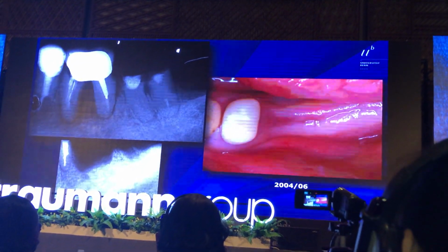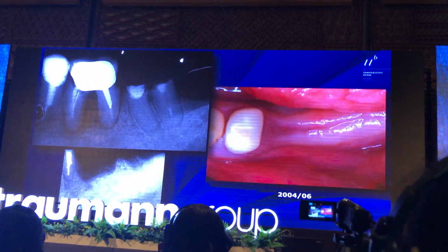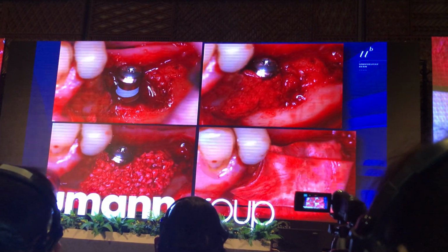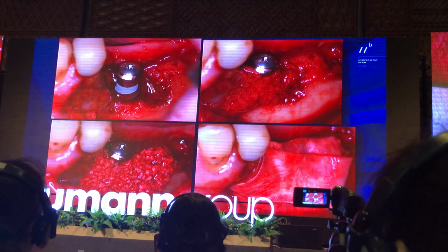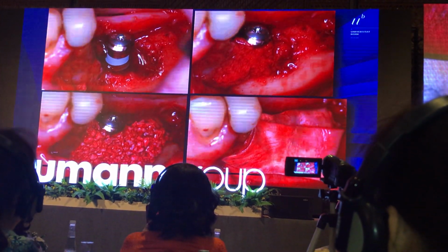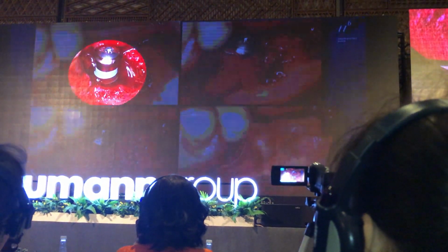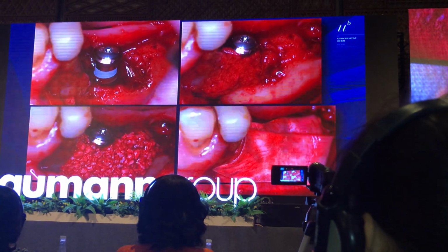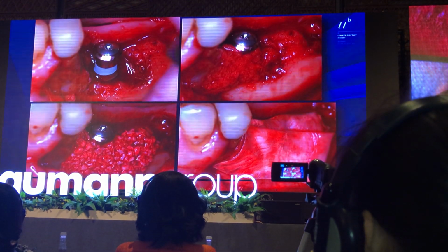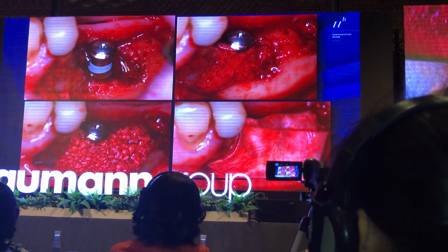And I said, oh my goodness, what was the problem here? Big lesion. So, see, that's what we got. When we opened up the site, you see a huge defect, huge. So here you see, this is the defect. You see, this is a dry surface. This is SLA. This is not SLActive, because SLActive was initiated in about 2006 in clinical practice.